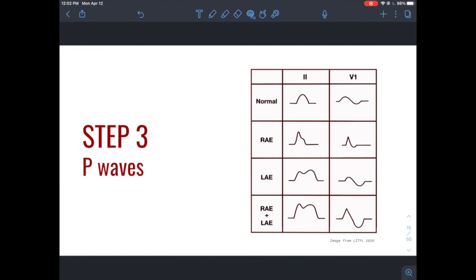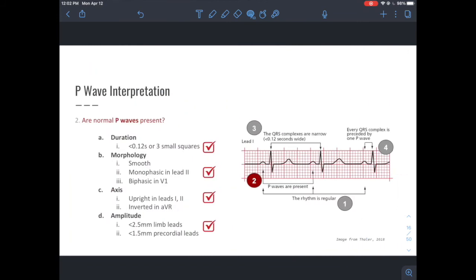Step three is P waves. The key questions are: duration — about three small squares; is it a smooth positive deflection; and is there a QRS complex that follows every P wave? That one-to-one relationship confirms normal conductance patterns from the SA node and atria into the AV node before reaching the ventricles.